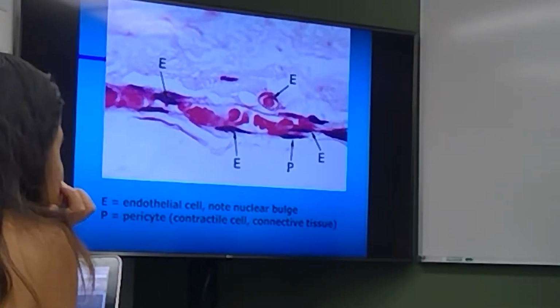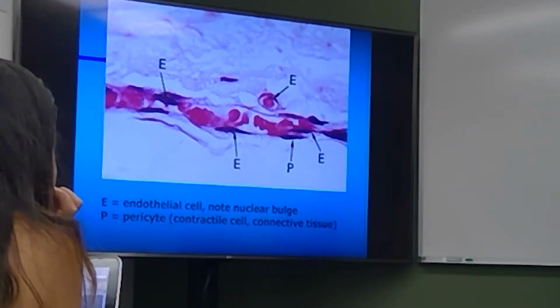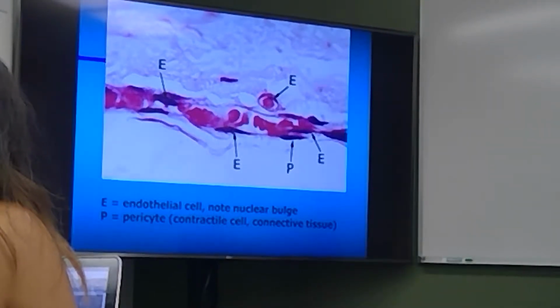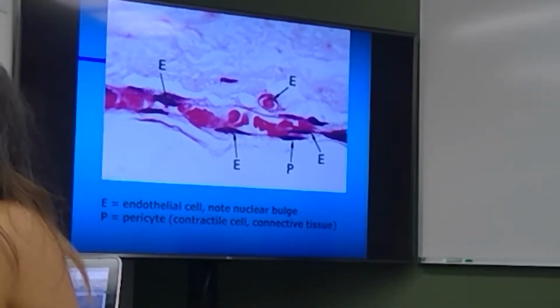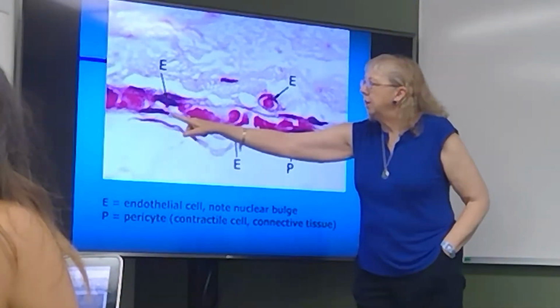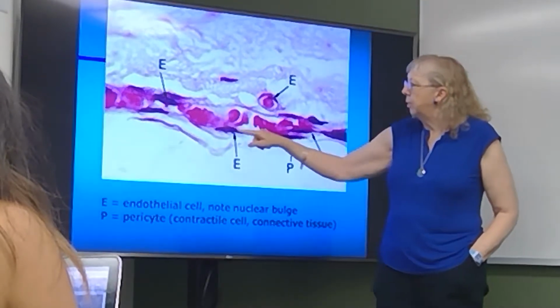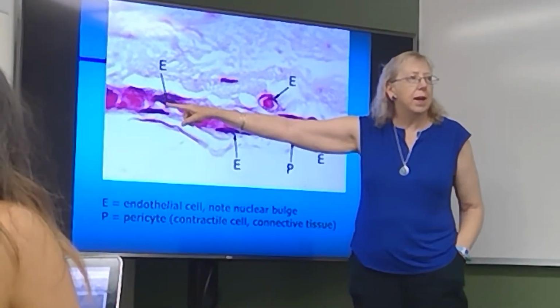We have also special stains using lots of different dyes, procedures that may give different components of cells different colors. But you need to remember that you're not looking just at differences in colors, but you also want to look for differences in structures, you know, shapes, how they connect to one another, size or amount of cytoplasm in relation to the nucleus, and that sort of thing. And so we have a capillary here that is lined by the squamous layer cells called endothelium. And the bulges of the nuclei are apparent here. And then in the lumen, we have red blood cells primarily passing along here.